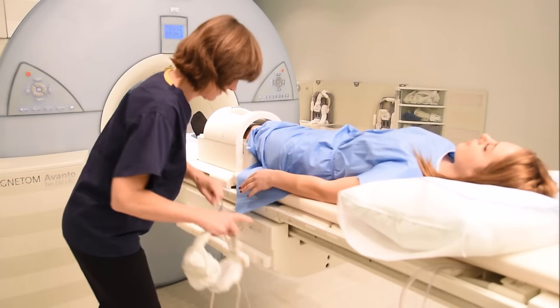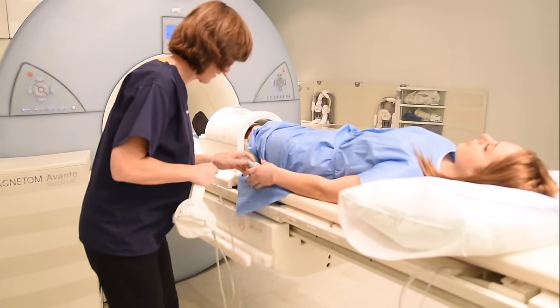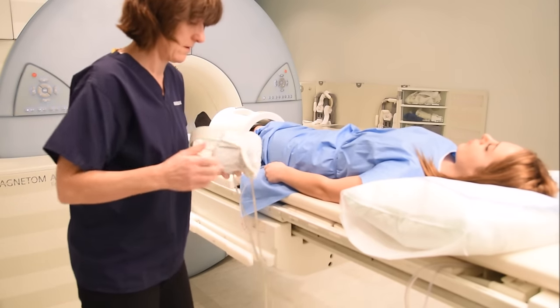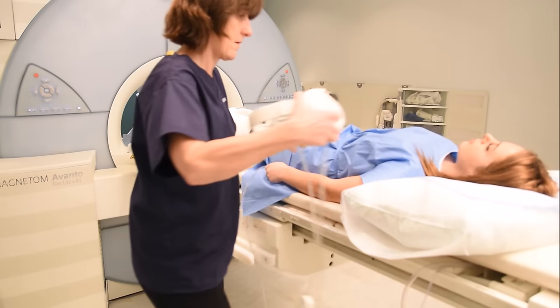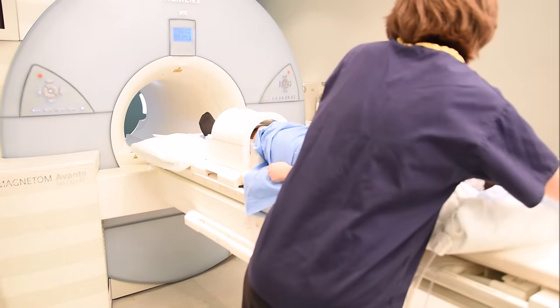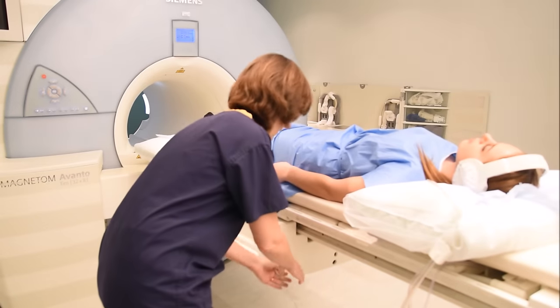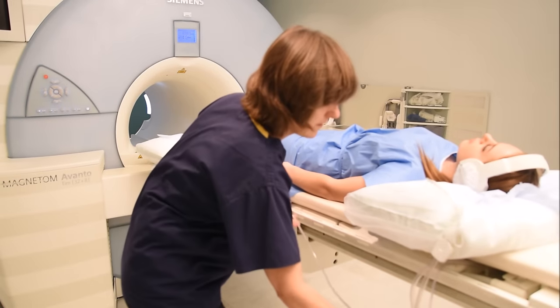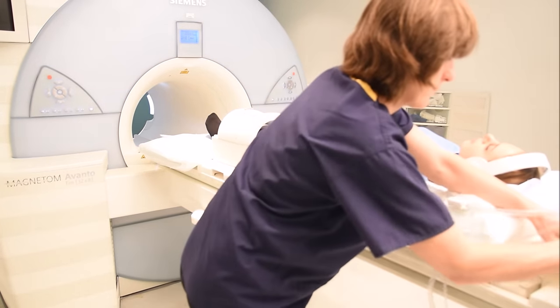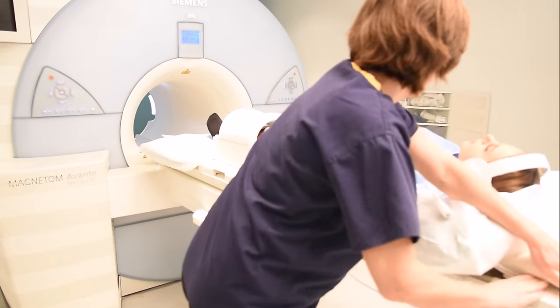Provide the patient with an emergency buzzer. Provide ear protection to reduce scanner noise according to your manufacturer's guidelines. Headphones will also enable communication with the patient during the scan.